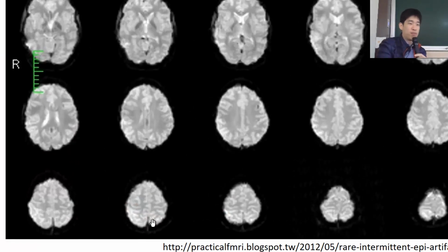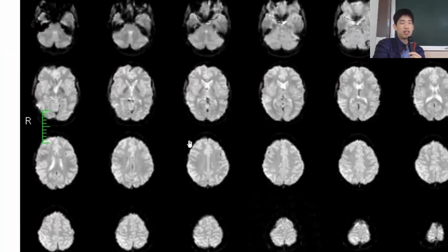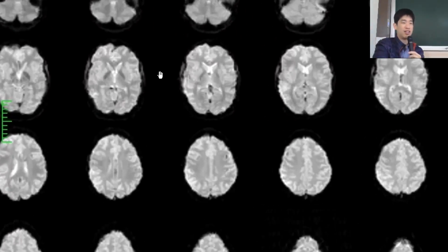So here is the raw imaging. We will have more chance to see the imaging. Actually, this image is a little blurred. If you see other MRI imaging, you will see this image has a very bad spatial resolution. Kind of blurred. You cannot see in detail.